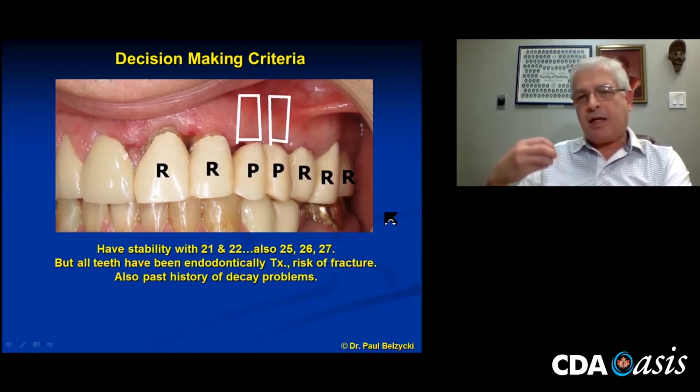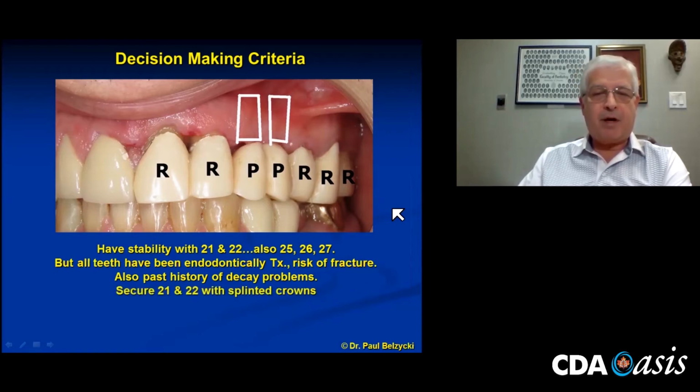He claims, Paul, that was then, this is now, I'm cleaning better, I'm brushing better, having gone through all this work. It just bothered me that if I strap all of this up with one porcelain fused to metal bridge, if he has a problem here, I have to sacrifice an entire quadrant to make something right.